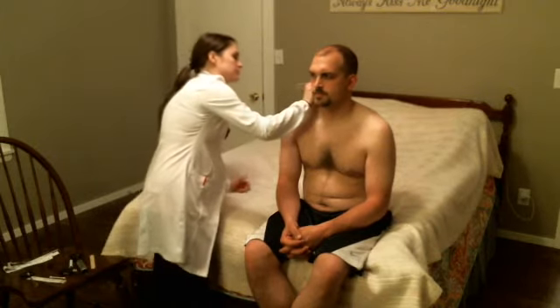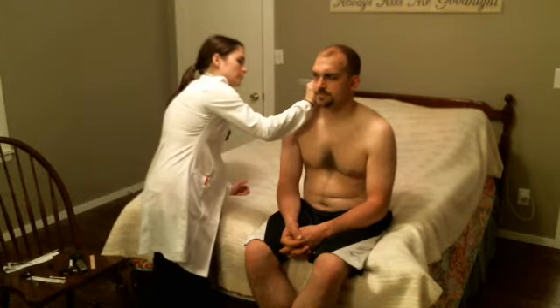Checking that air conduction is greater than bone conduction. Tell me when you can't hear it anymore. No. Good. And with this side, tell me when you can't hear it anymore. No. Perfect.